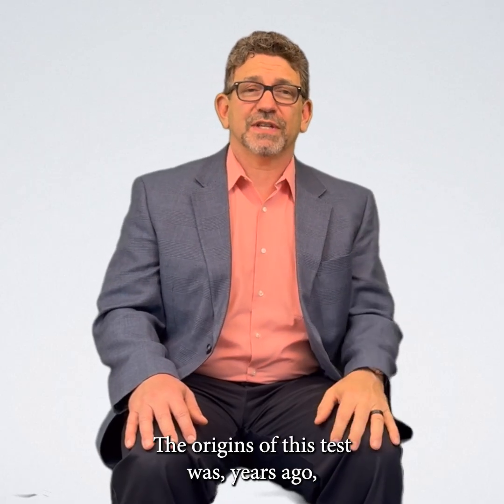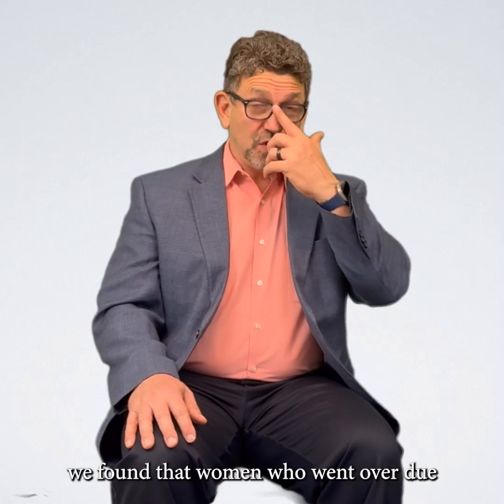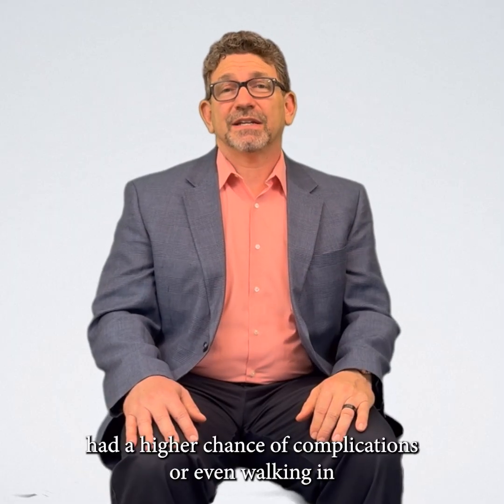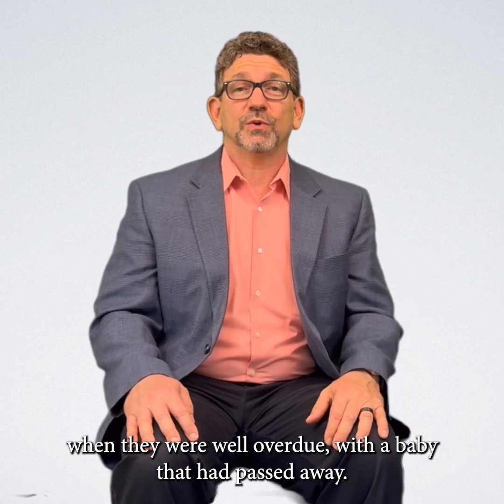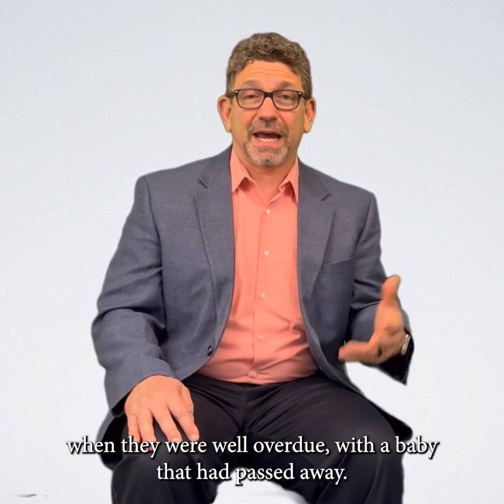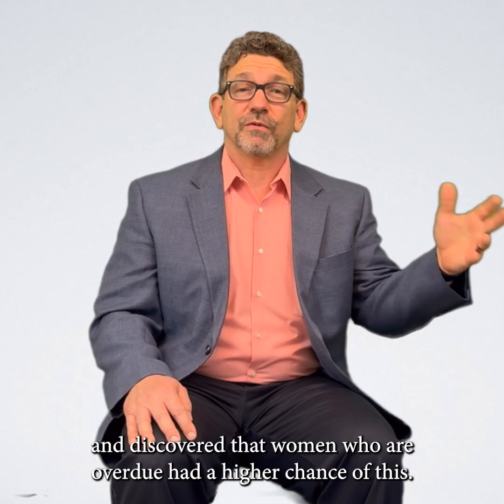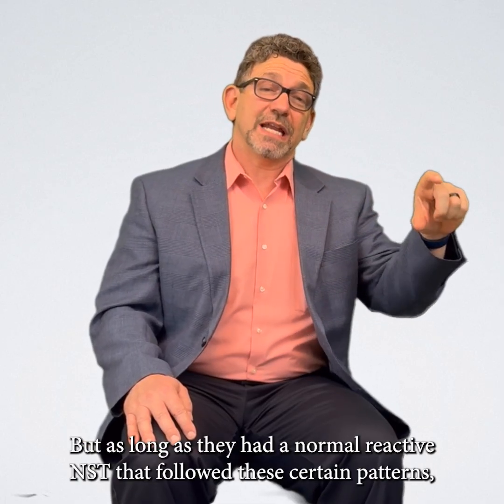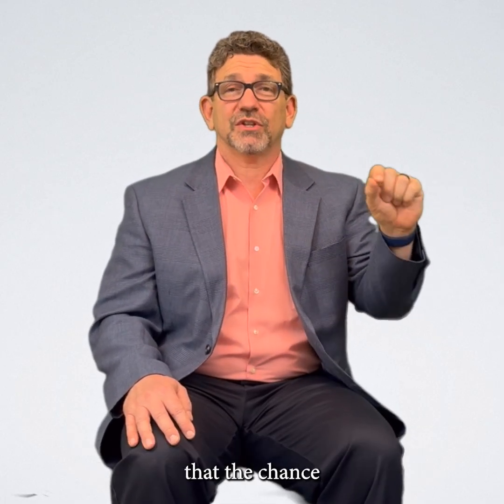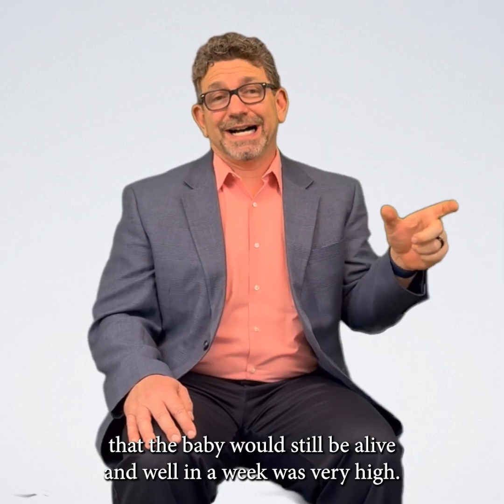The origin of this test was years ago, we found that women who went overdue had a higher chance of complications, or even walking in when they were well overdue with a baby that had passed away. And they learned over time to watch for patterns, and discovered that as long as they had a normal reactive NST that followed these certain patterns, the chance that the baby would still be alive and well in a week was very high.